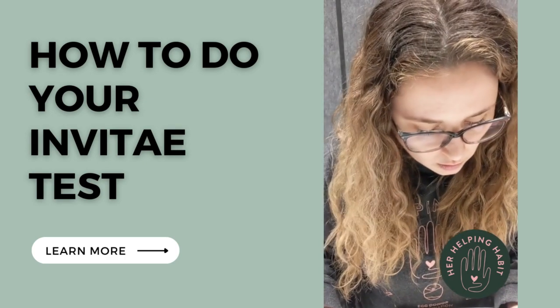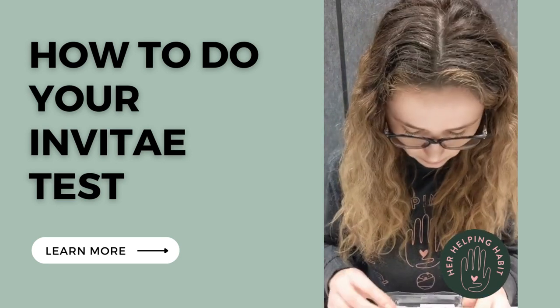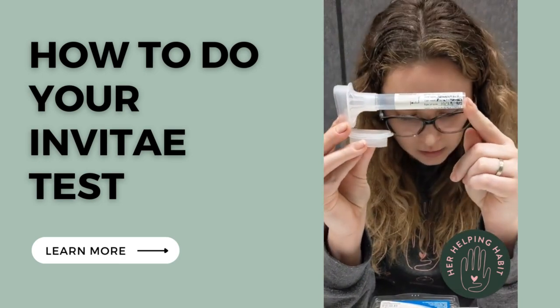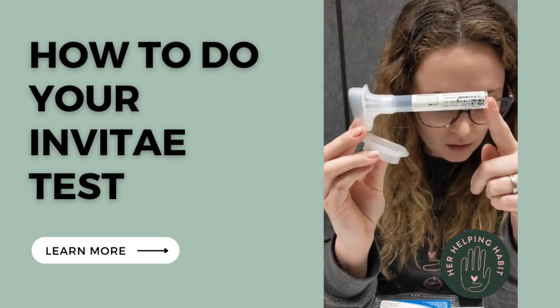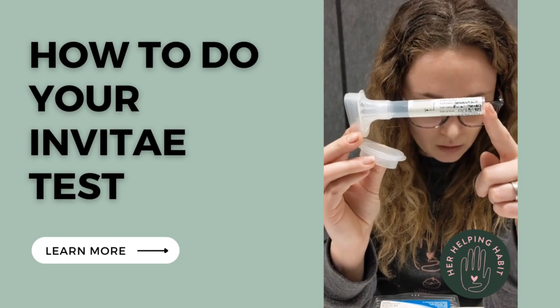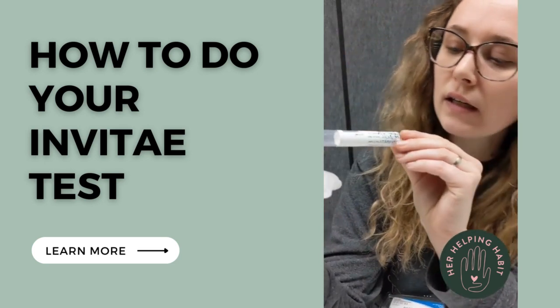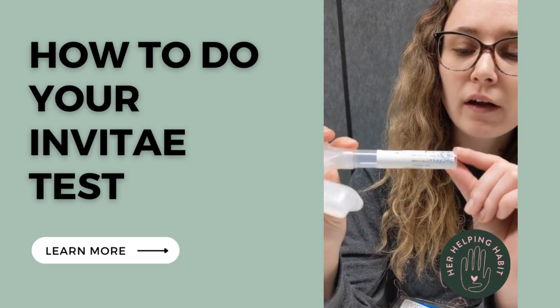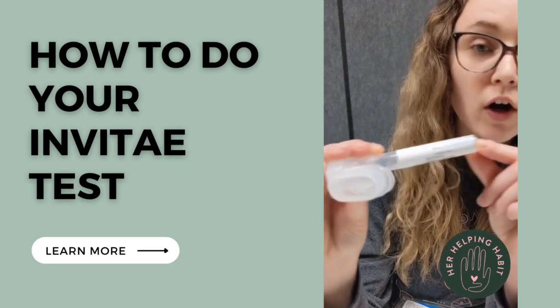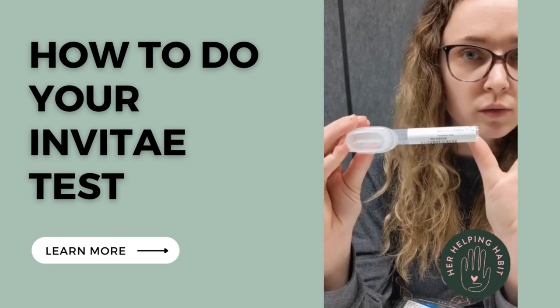First I need to label my tube. On the tube you're going to put your legal first name and last name, your date of birth — month, day, year — and the collection date, which is today's date. You can see this is just a fake name I've put here. There's also an RQ number field — if you know your RQ number, great, put it in. If we haven't given you an RQ number, don't worry about it, just leave that blank.